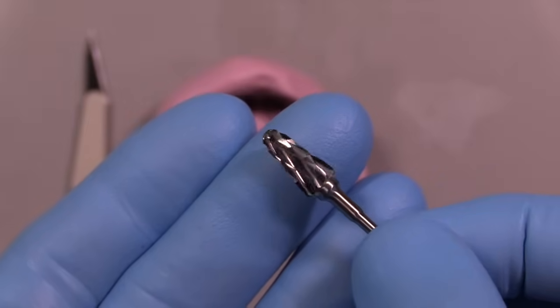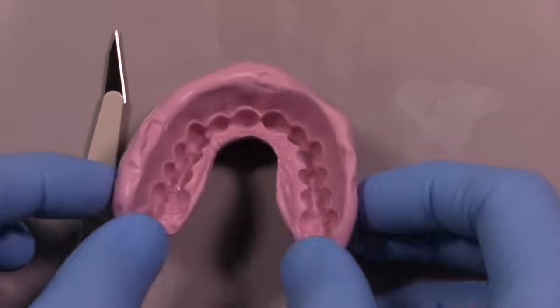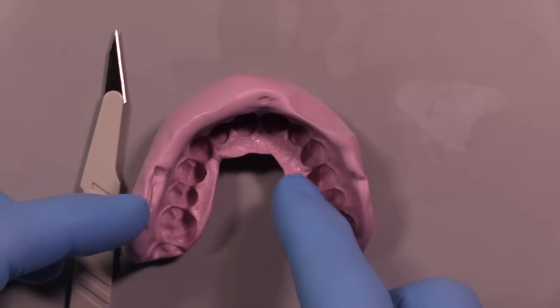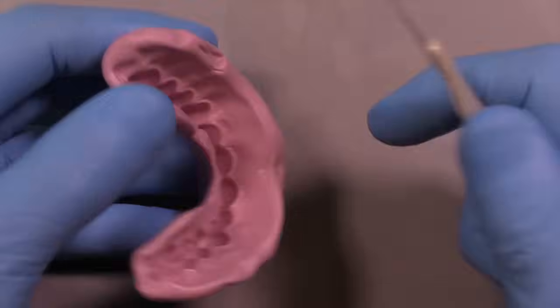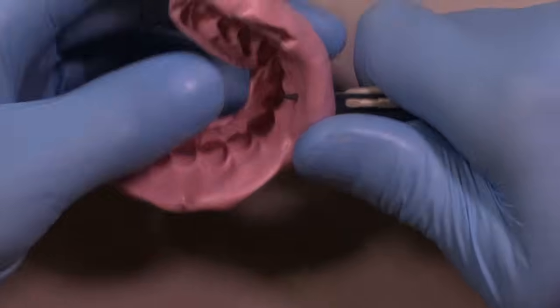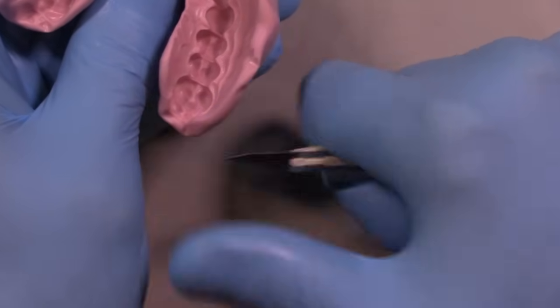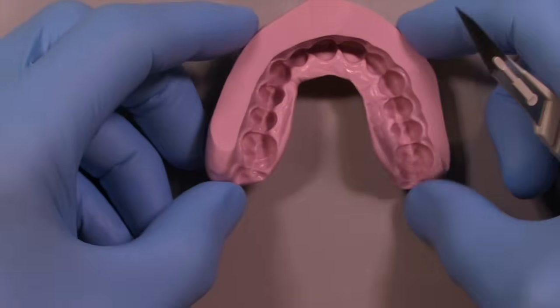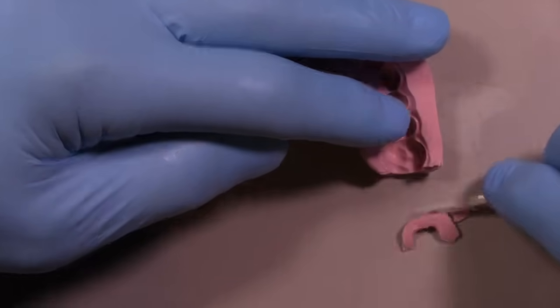This is another way to trim these — a coarse acrylic burr, available from Brasseler and many other companies. We can use this to trim the stent back to a smoother and more uniform shape. It's critical that you have a very sharp new scalpel. I like to use sterile scalpels on these simply because laboratory scalpels that we have lying around are probably not that clean, and I like to try to do this in a clean environment so that the stent is kept free of unnecessary debris. I've just trimmed away a little bit of the gingival area.